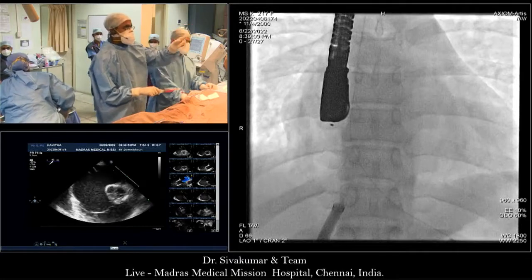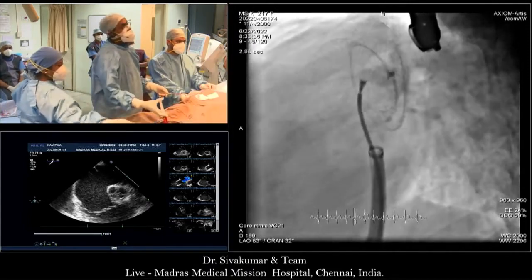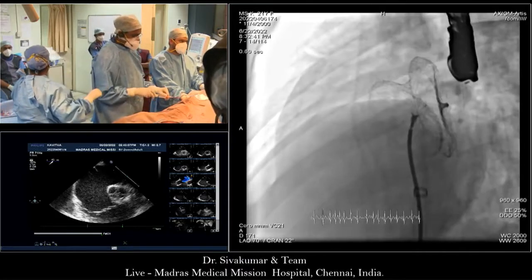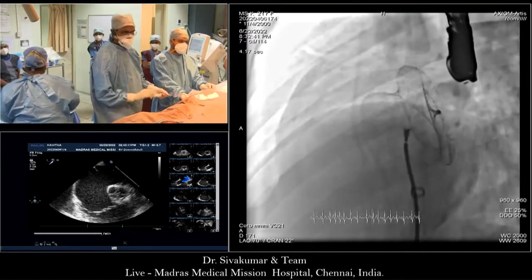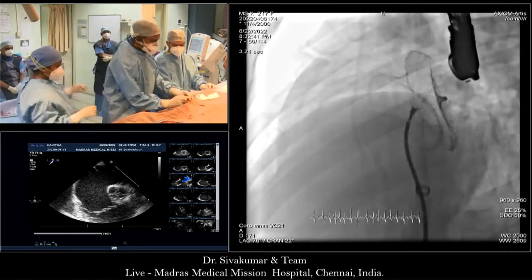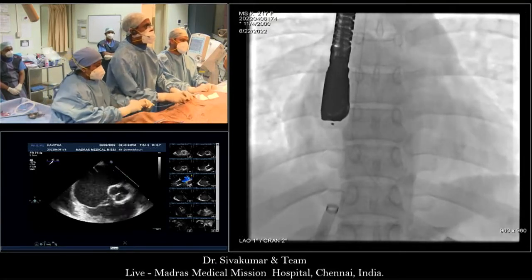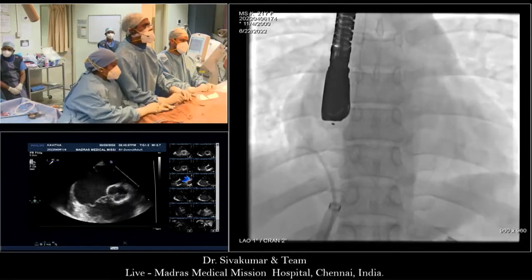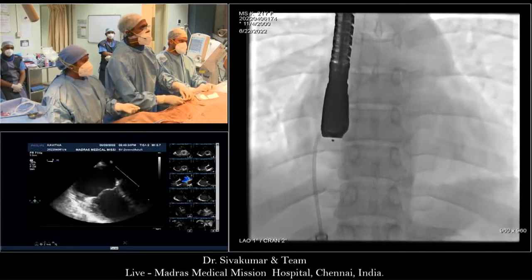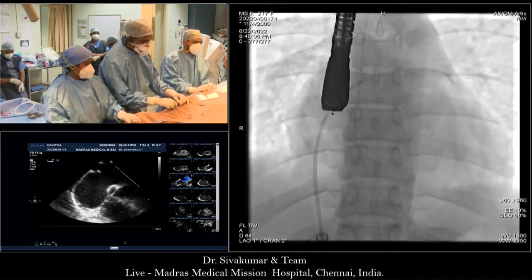Show me that LAO picture. LAO. Nick, come to the microphone. So now that he's taken it out, you've made him take it out. What size do you suggest he tries? Well, we had the 32 millimeters in measurement. We had the very good argument by him that small rims need a little bit more support. We had Saeed's recommendation. We all know Saeed is Mr. Erosion, that's for sure, so don't listen to him. But he also said his upsizing is fine, and we see that 40 millimeters is, in my humble opinion, overdone. So I would go for in between the 40 and the 32, which is 36.